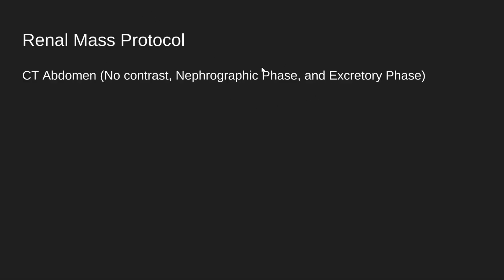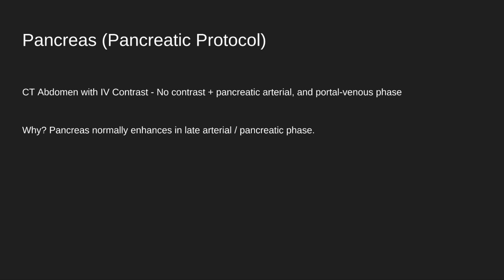And you mainly want to focus on those two phases, of course, the nephrographic phase and the excretory phase. And why? To characterize the mass. If there's a mass, you want to characterize it. Now, what about the pancreas?